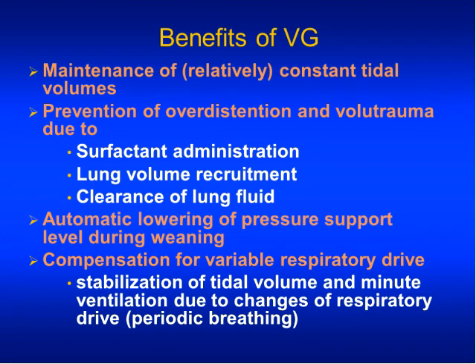It's real-time weaning. Volume guarantee doesn't wait for the next blood gas. It doesn't wait for rounds to make a decision. It's not afraid that the attending will yell at it for doing the wrong thing. It does what it's programmed to do in response to improving pulmonary status and the baby's overall well-being and increased effort.